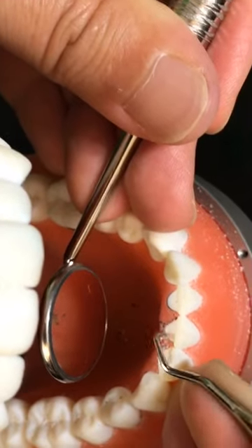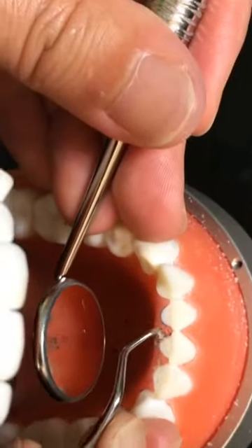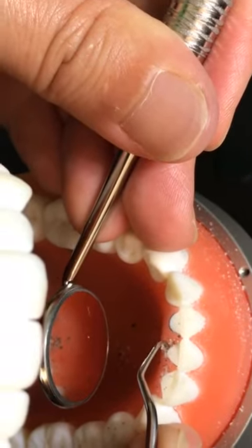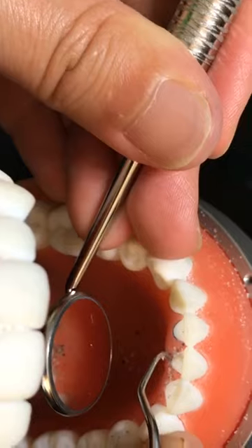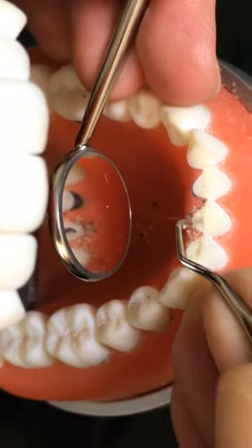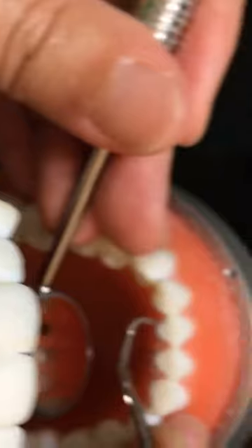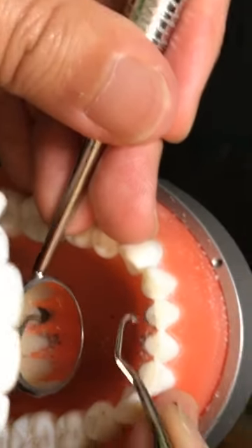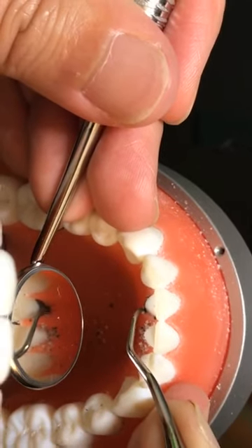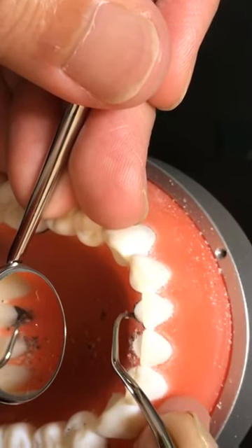You're seeing this from the side. Here — surface away — you're adapting the terminal shank to that surface, then going towards the straight angle, and then coming around to the mesial. It's not a deep pocket. If there's more than five millimeters of pocket depth, this blade — the blade is only five millimeters long — it won't reach the base of the pocket. Be sure it's not too deep a pocket, but you can go subgingivally up to a five-millimeter pocket.